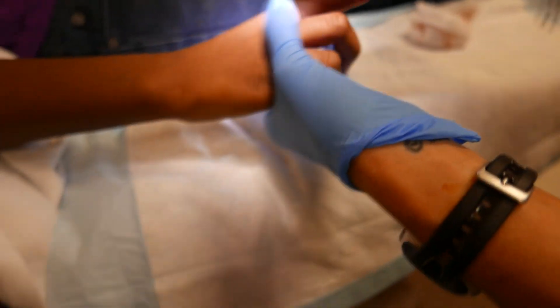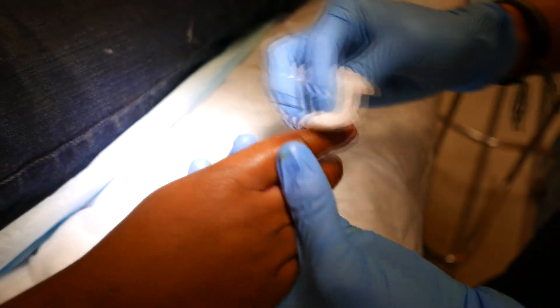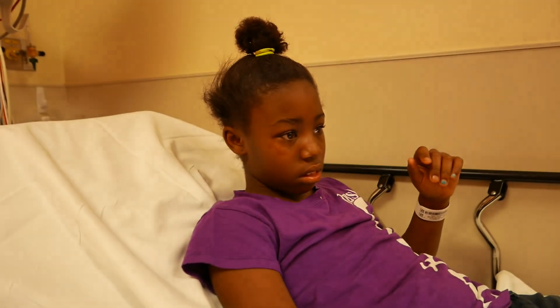Flip your hand. Okay. So we'll put some antibiotic ointment on top of that and a Band-Aid, and she should be good to go. Did you feel anything at all? No? All right. You were brave. You were brave.